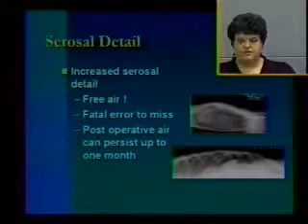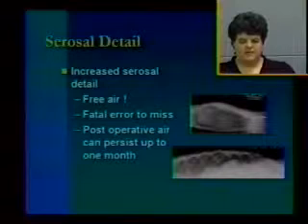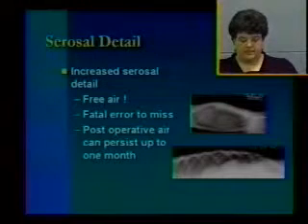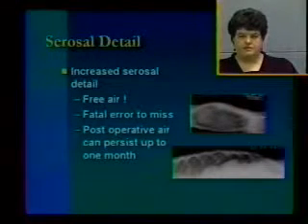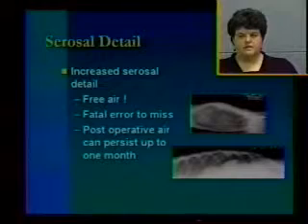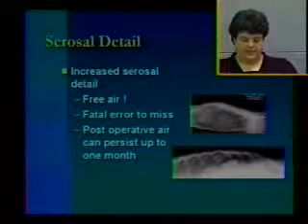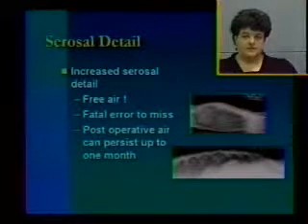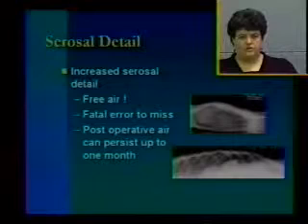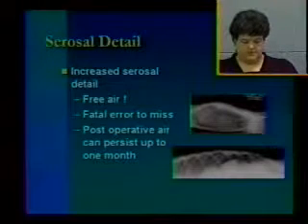If you have any concerns, if you see the unusual gas bubble outside of the GI tract, or the gas dissecting between the liver and the diaphragm, which are the typical places to identify them radiographically, what you need to do is go ahead and put the dog in left lateral recumbency, and if you have the potential, shoot across the dog and across the table. Because what will happen is the air will float up to the top and will outline the diaphragm as you see here. So with the lungs on one side and the free air in the abdomen, you outline both sides of the diaphragm. And then you can actually see the liver lobes being outlined, and that's the rounded structure right underneath the ribs.